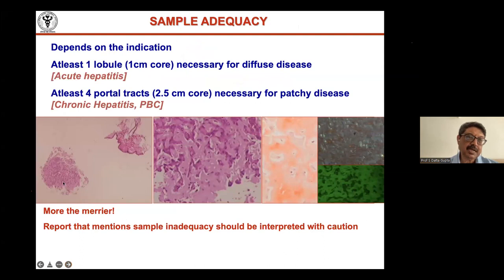This was a biopsy that we received, a small bit here and a skin here. So a new resident must have done it and pulled out a bit of skin and this. And this was sufficient. It showed amyloidosis. This is the Congo red, and this is the apple green birefringence, and this is thioflavin T, which gives a fluorescence with amyloid.